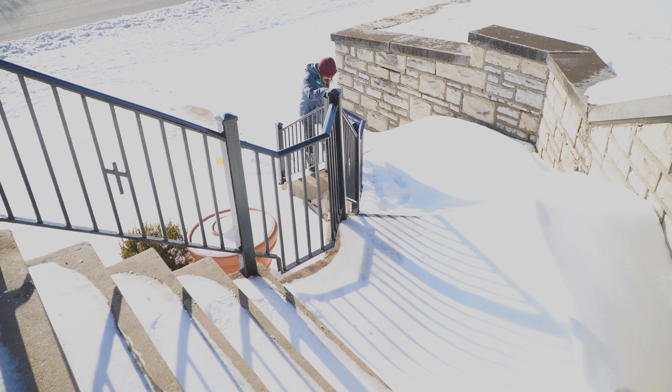In a slushy parking lot like this, walking on it is not really too hard — you just have to watch your step because the ground is really uneven. It's not really too much different from walking on any kind of other uneven ground. It's really not that bad.